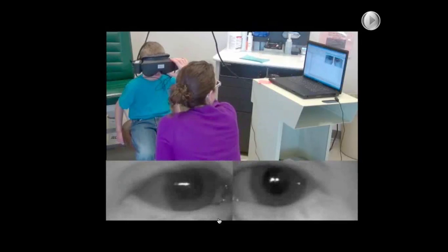It does need to be done in the dark, with the exception of babies under 6 months, and that can be a challenging thing for children to do. So most children don't like the word dark and don't like thinking about being in the dark, and so initially when I started to do this type of testing, I would make the mistake of saying, okay, it's going to be dark now, and they would get very anxious. And so now I avoid that type of use.